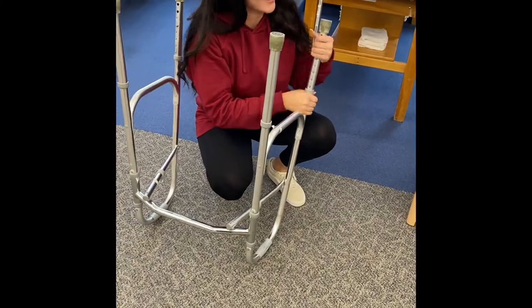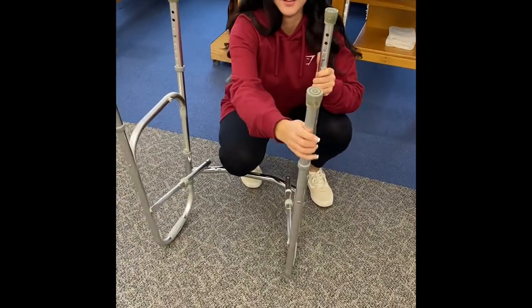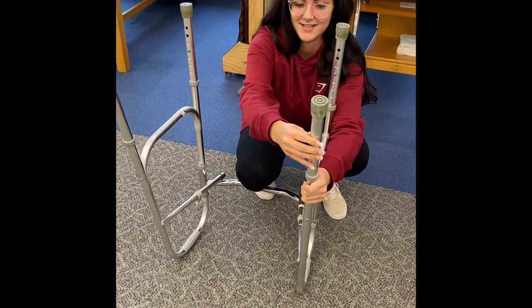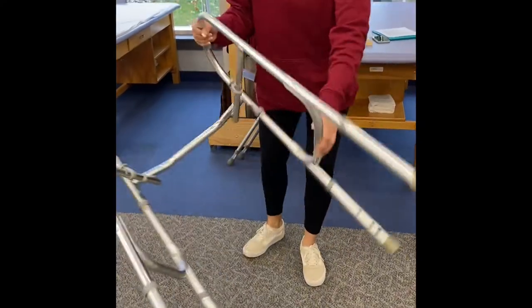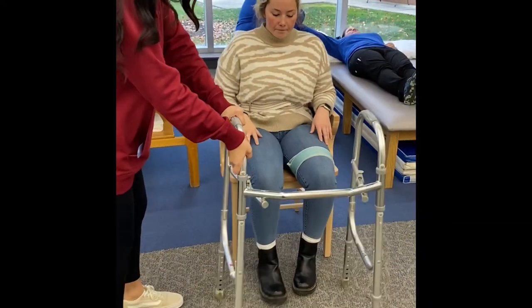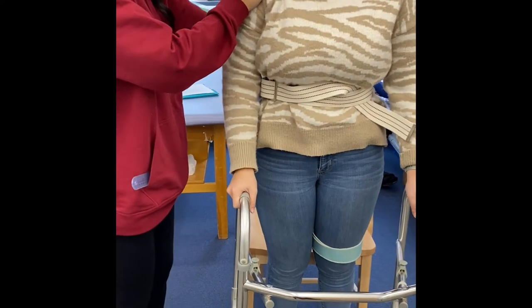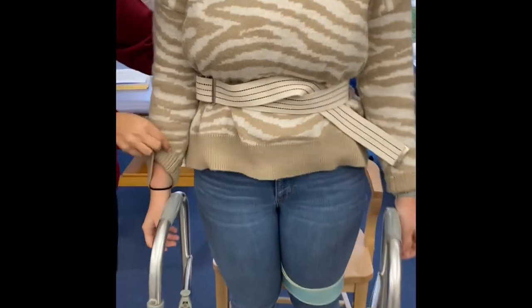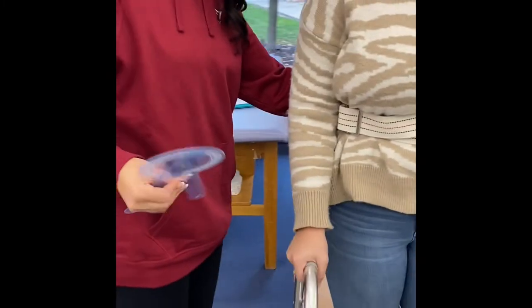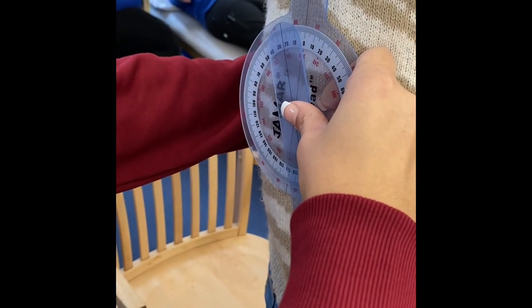This one's not going. Okay, here we go. That one went. Now that they're all adjusted, we're going to stand you up again. One, two, three. Again, the back legs of the walker should be at the midfoot. And then you can relax your arms for me. It's now at her wrist crease, so we're going to measure with the goniometer. It should be 20 to 25 degrees, which it is like 23, so that's good.